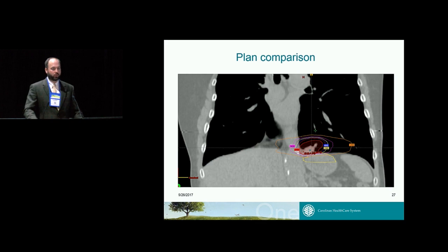You can put your bone contours, and we're working a lot on algorithms, and I know that they're coming out with new algorithms to do triggered imaging tracking with other locations. But as far as what's available now, you can only track fiducials with it. Only fiducials, not for lung? For the lung, you can't track anything. You could track a bone. Again, I think they're working on algorithms, much like CyberKnife, which tracks a tumor, to broaden that spectrum of what you can do with triggered imaging.